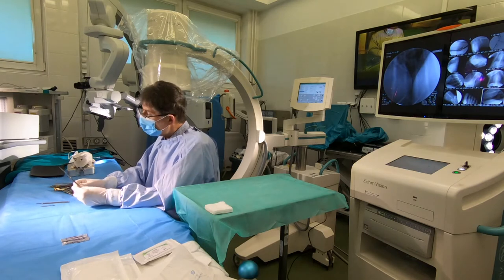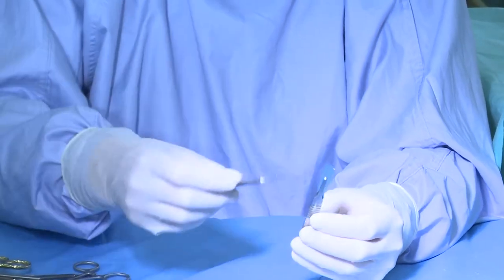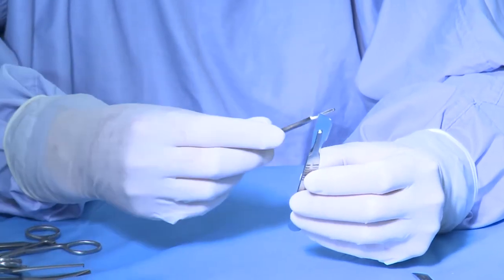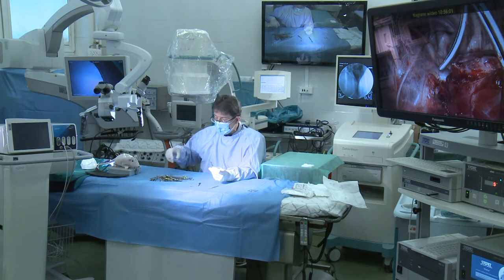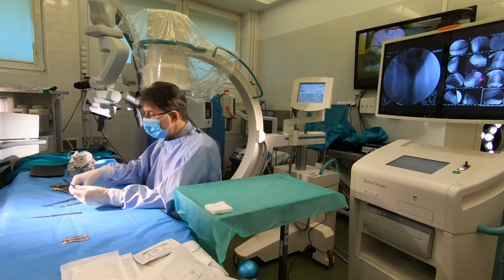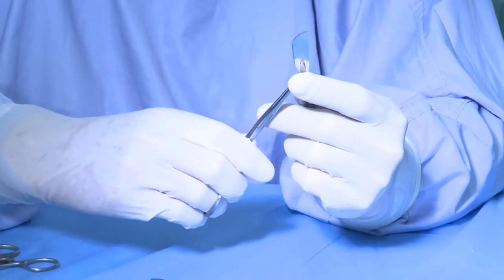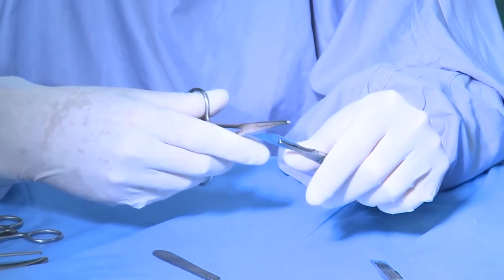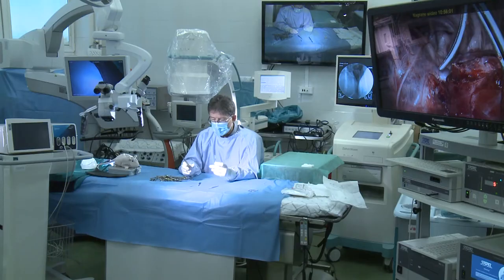Positives and negatives: the first type is very simple and historically used. The disposable blade is very handy because we don't need to sharpen it — we can just remove it and change to a new one on our holder, even during surgery. How to fix and remove it: first of all, be careful, it is sharp. We usually use forceps for both removing and putting the blade in, and the forceps must not touch the sharp edge, otherwise we may damage it. So, this is the scalpel.